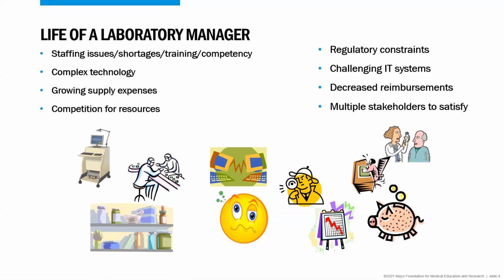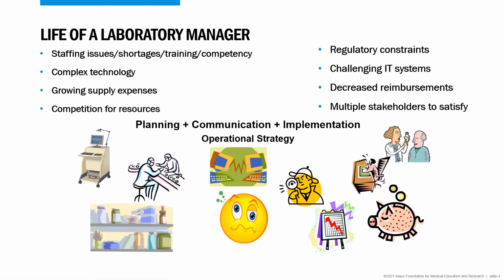So understanding and knowing your stakeholders also helps in delivering the service that you need to provide. We have different types of patients that come to the work area. Some come for blood work, others come for urine, all the different types of body fluid collections. We have to know all these different stakeholders so we can provide the services that each one is there for.